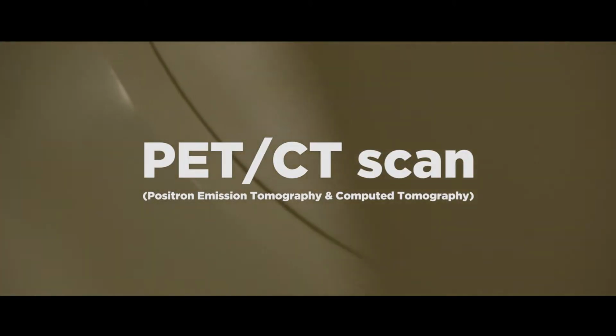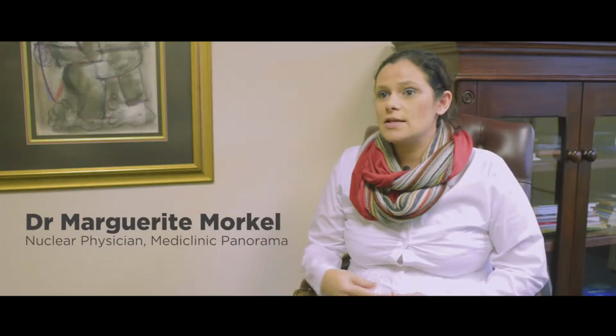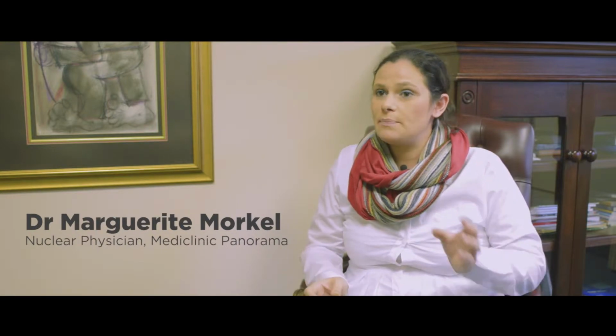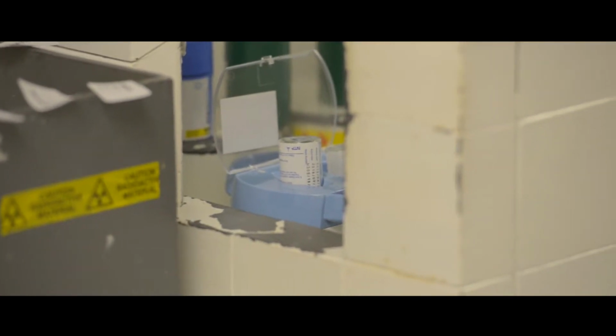PET-CT scan is a dual imaging modality. It is where we look at functional as well as anatomical imaging. That's why it's called a PET-CT. First of all, we inject you with a radioactive substance, which is then taken up into the cells.